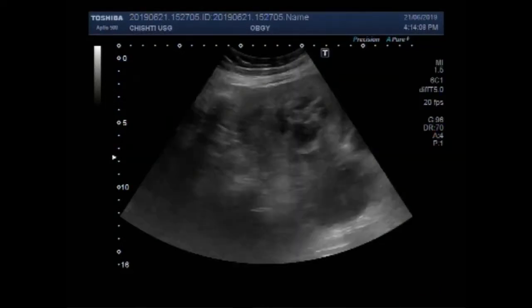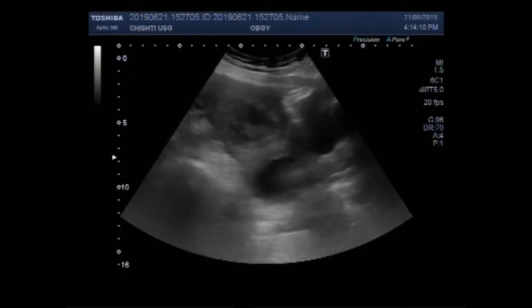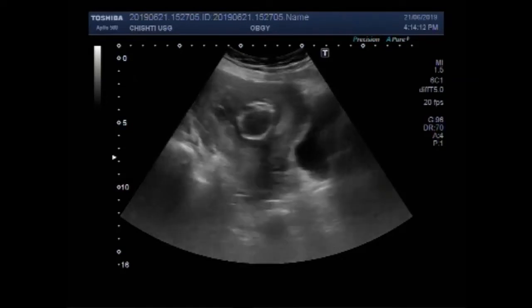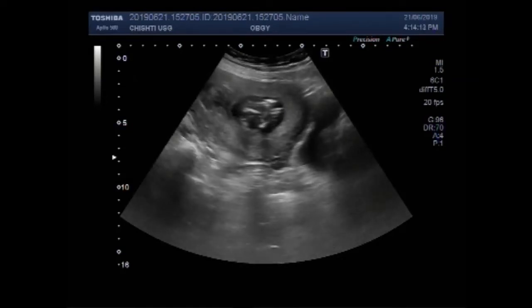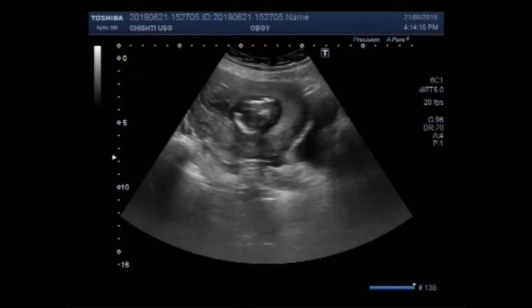Dear viewers, I hope you are all fine. This video shows a fetus with fetal demise, a large ovarian cyst, and a mass in the anterior wall of the uterus.